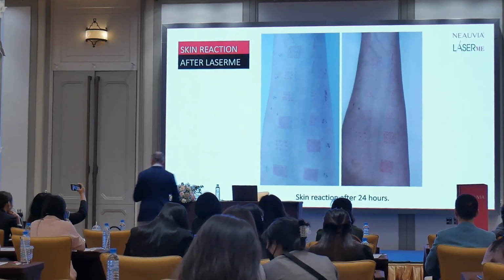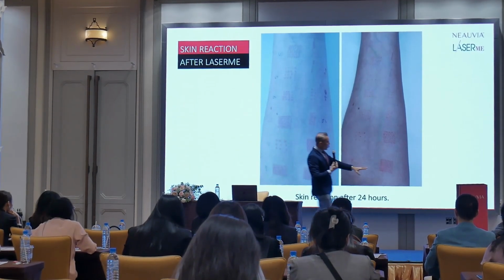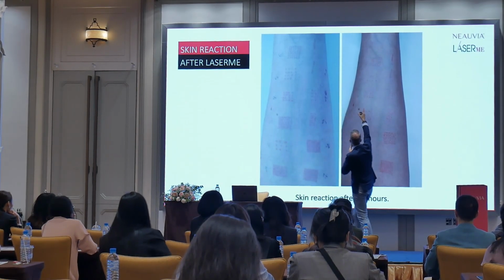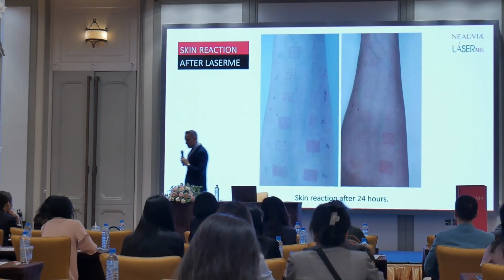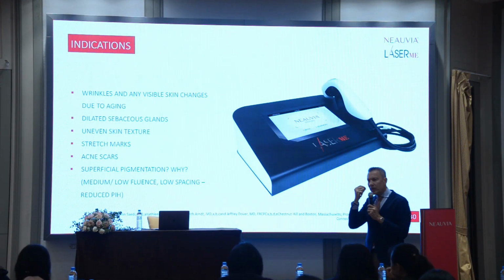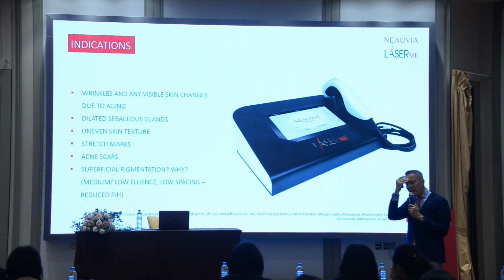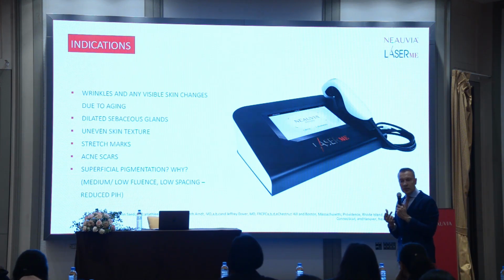The ones you see here below, these are settings that we use very seldom. Only when you have post-acne scars are you going to use this kind of settings. Most of the time, you are going with the settings you see here above. So you will have these white spots maybe for 24, 48 hours, not longer than this. So when you have acneic skin with some wrinkles, some acne, even a wrinkled forehead, it is very good for stretch marks, acne scars, post-acne scars, and also pigmentation.